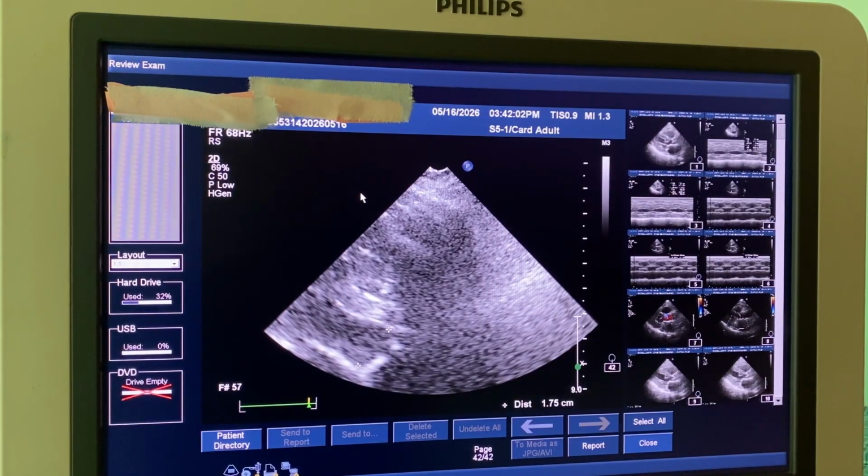So what we are going to use, equation of continuity, to find the aortic valve area. Equation of continuity. What does it say? You still remember? You read it the other time. That is in relation to Bernoulli's principle. In a closed system, the volume of blood passing one point equals the volume of blood.